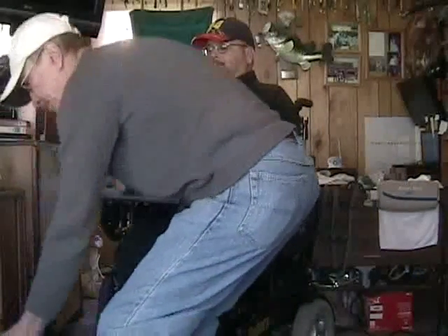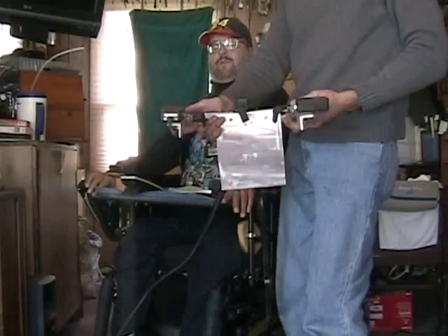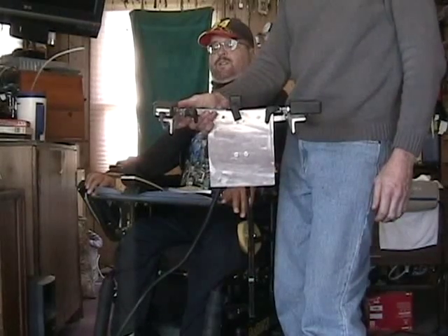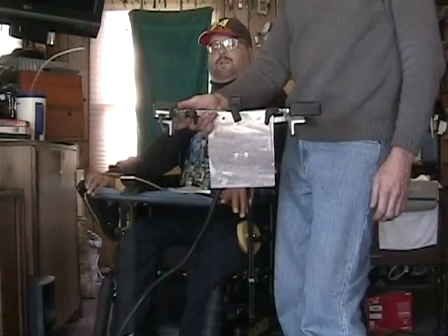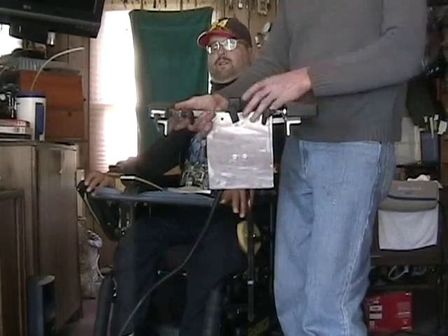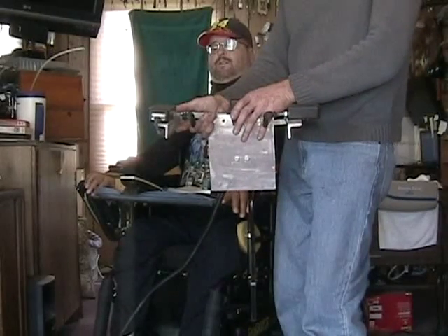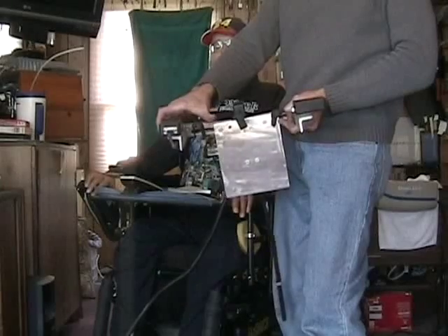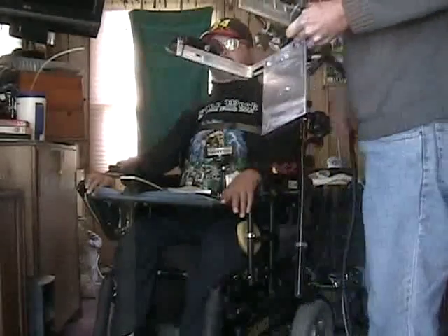All that being said, we will show you now what Dan's Fishing System looks like and how it operates. The first part is the headrest, and this can be modified for people that would use it differently, but this is how I like my setup. It starts off with a twitch mechanism on the left side. The back side is a button that I hit to set the hook, and the right side is a variable speed control for the reel.